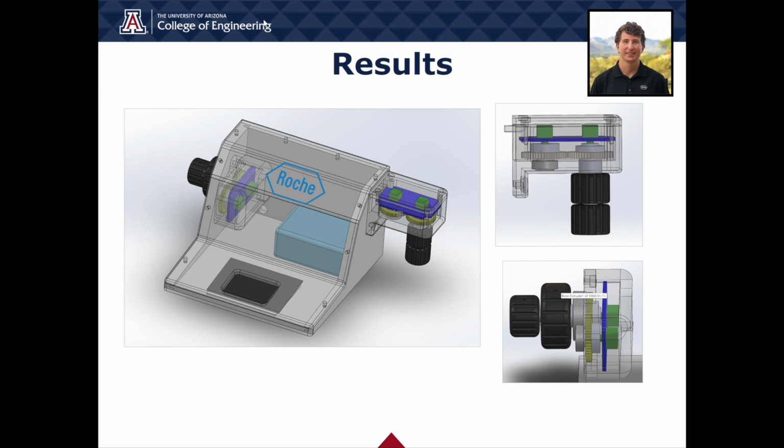Hello, my name is Daniel June, and I am the mechanical engineer for the project. Our design is meant to mimic that of traditional microscopes, dimensions and controls wise, that are currently found in laboratories today, with the added benefit of a trackpad that allows for a secondary means of X and Y panning.